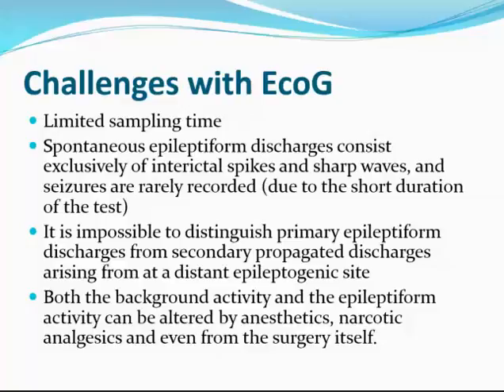It is impossible to distinguish primary epileptiform discharges from secondary propagated discharges arising from a distant site. Both the background activity and the epileptiform discharge can be altered by anesthetics or by narcotic analgesics, and even the surgery itself.